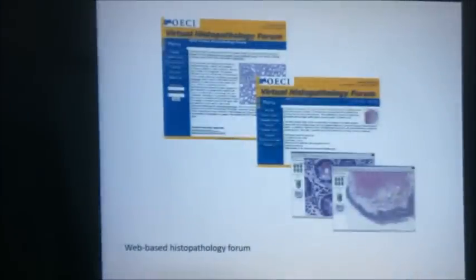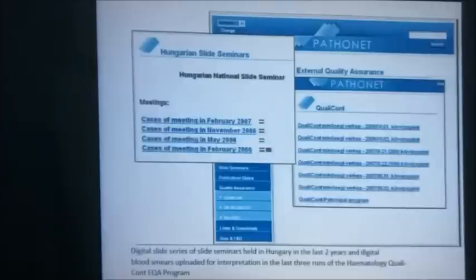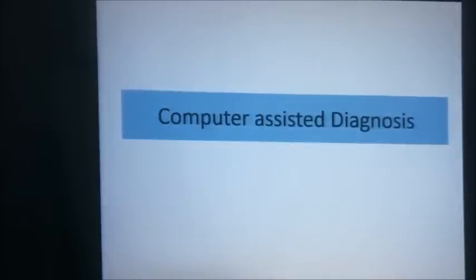Say for example, if you're examining for a melanoma or whatever, you can do the measurements actually on the slide. No need to have a graphic view. So virtual histopathology or digital histopathology, now this is the era of histopathology. This is the new advanced techniques. Okay. And you can see many websites starting to have this, Pathonet, PathXL, iPath, all of these collecting slides.